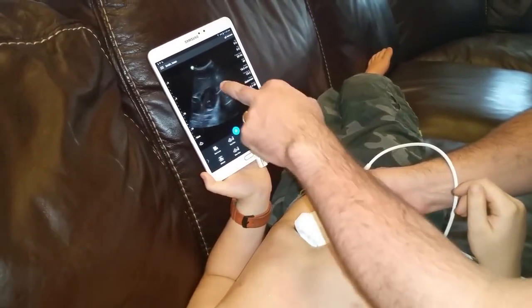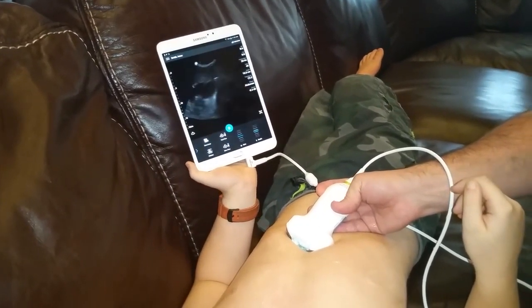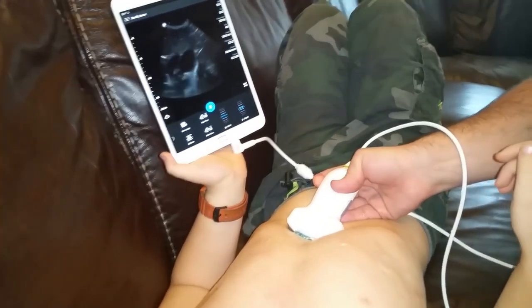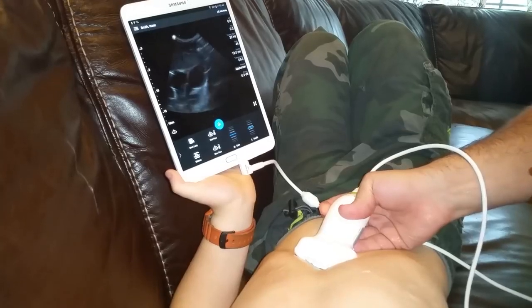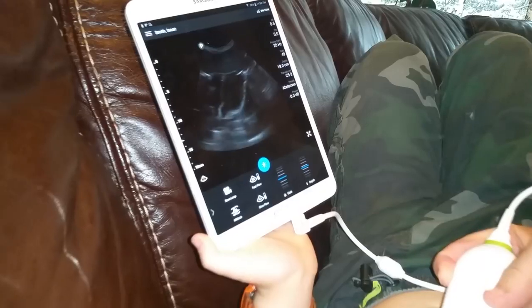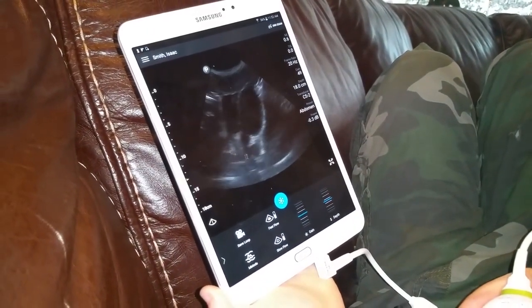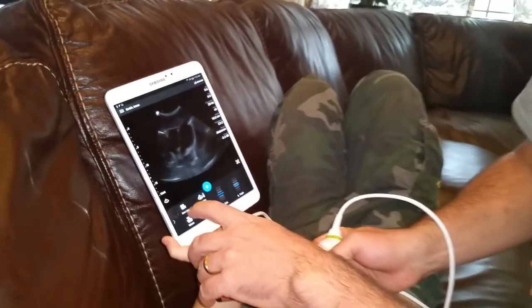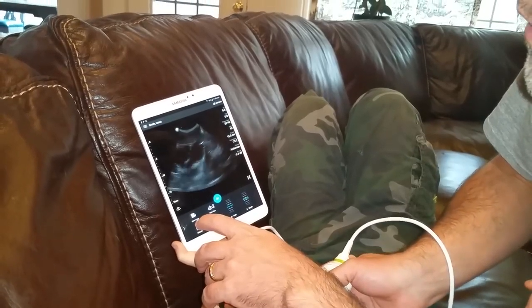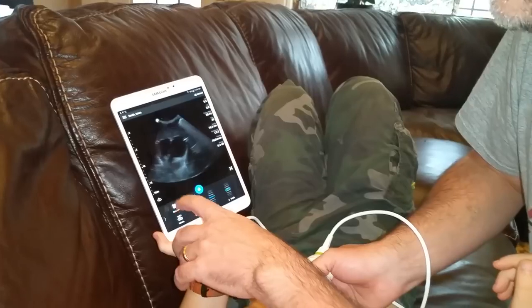Right there you can see the left ventricle, and the right ventricle is coming into view. If you have your patient bend his knees, that can help with relaxing his belly a little bit and getting the picture to come into better view. Then have him take a deep breath and hold — you should be able to focus a little bit better as well. You can use the liver as your acoustic window, and with a little bit of effort you can get all four chambers. Then click Save.